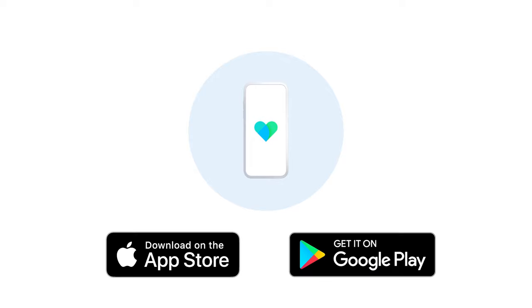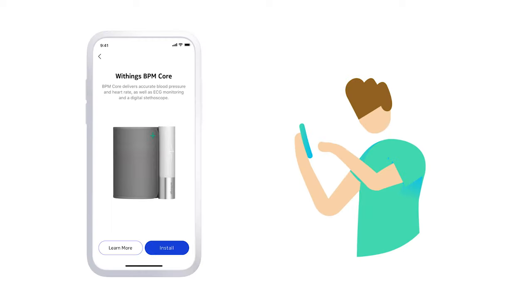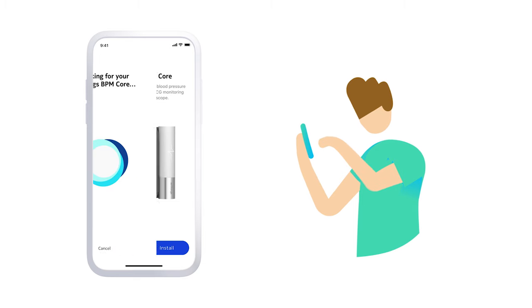Here's how to get started. First, download the HealthMate app onto a compatible smartphone or tablet and follow the quick instructions to set up the device via Bluetooth.